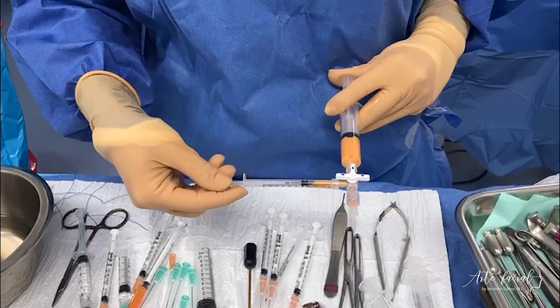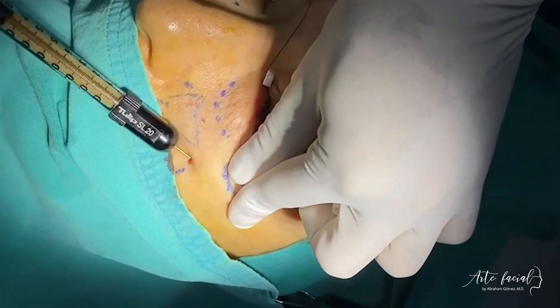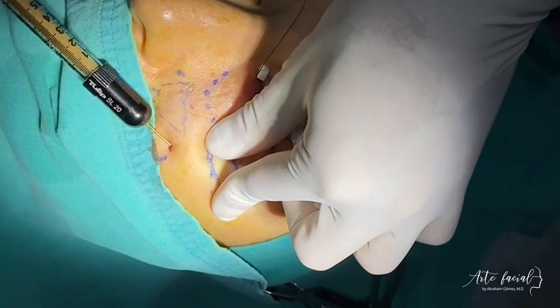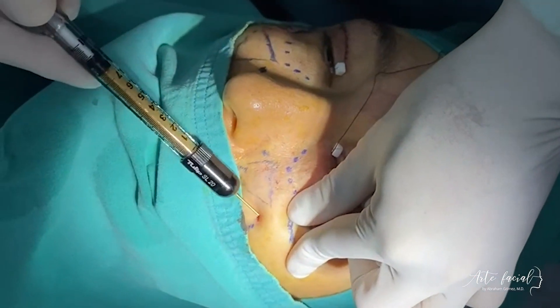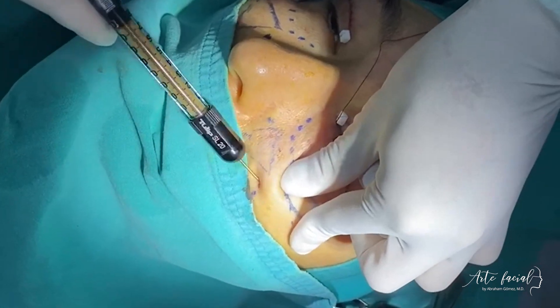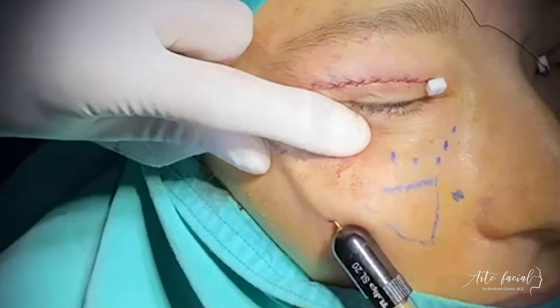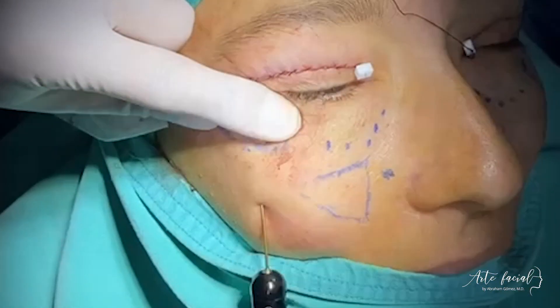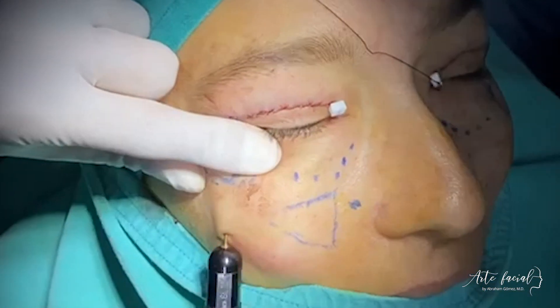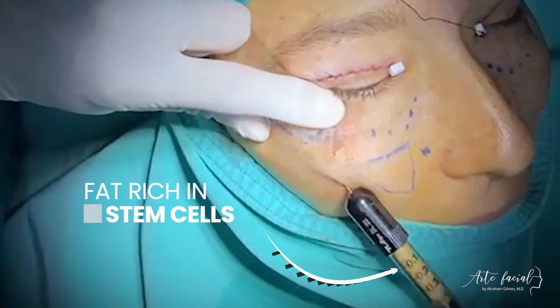The fat is injected through very small incisions in the skin using a meticulous technique in an artistic manner. Tulip infiltration cannulas specifically designed for this purpose are employed. The length and caliber of the cannula should be carefully selected according to the anatomical area.